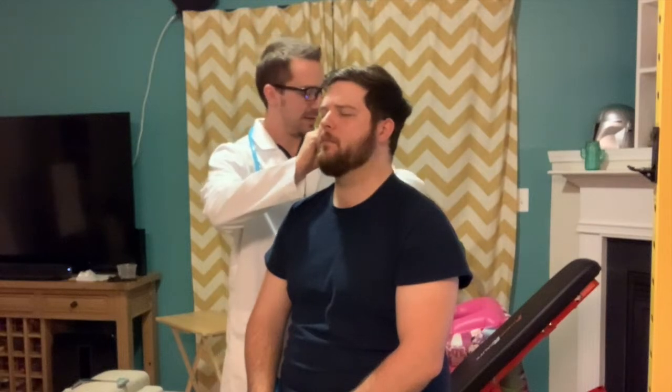I hear it. And tell me when you don't hear it anymore. I don't hear it. I hear it again. All right. Was it louder on the bone or over the ear? Over the ear. Okay, perfect. About 30 seconds. All right, so one more time on the right. Close your eyes for me. I hear it. Yep. Excellent. So tell me when you don't hear it anymore.